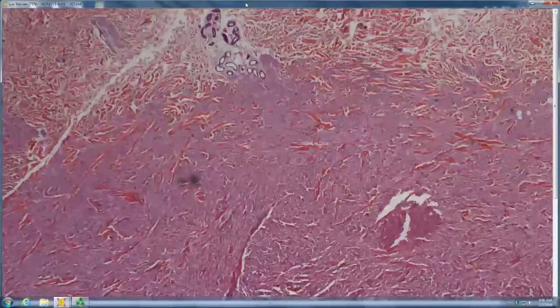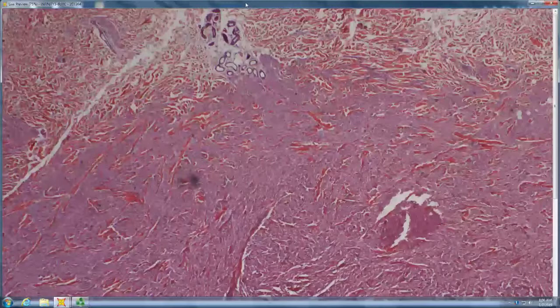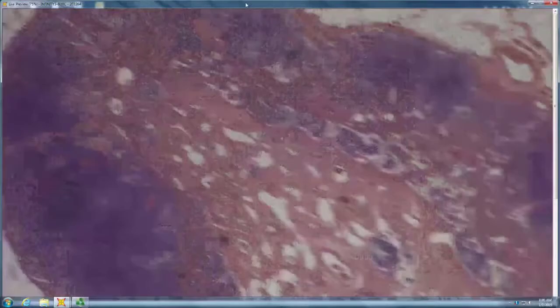Usually ropey collagen trapped in it is common. So the ropey collagen, normal collagen, not sclerotic collagen. Correct. Normal, not newly synthesized, just normal collagen.